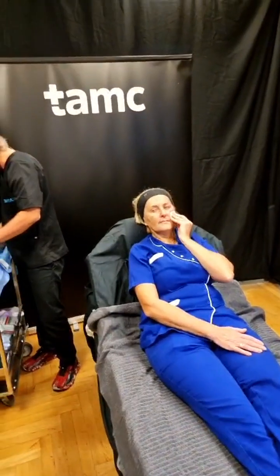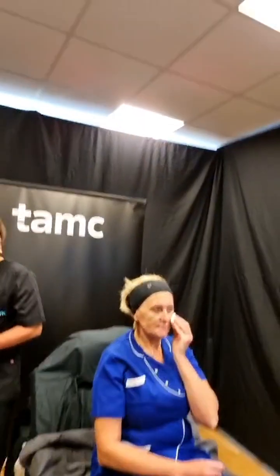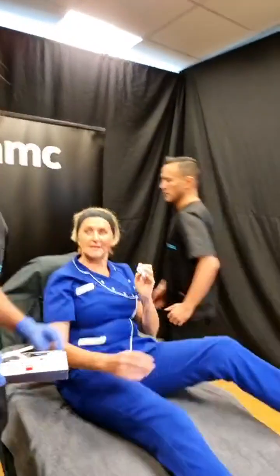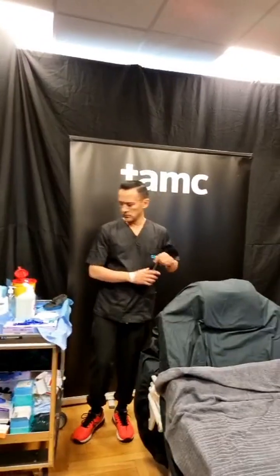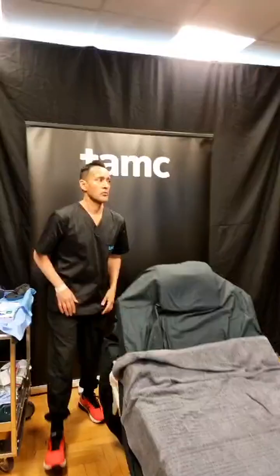Okay, guys. Good morning, Tatiana. How are you? Good morning, Tatiana. I'm fine. Hope you're well as well. So now. Okay, you can start. Okay. Thanks. So now, where am I taking this now then? I'm starting with forehead.